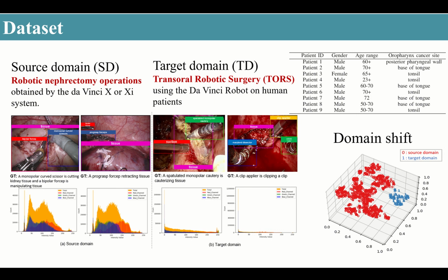Now we will introduce the dataset used in our work. The source domain dataset is from the robot instrument segmentation dataset of the endoscopic vision challenge. We have collected the target domain dataset of transoral robotic surgery using the robot on human patients.